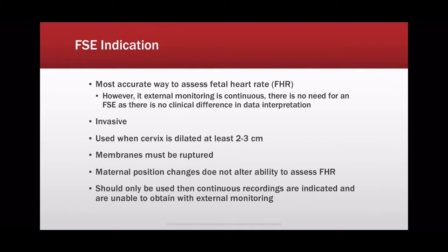Placing a FSE is actually the most accurate way to assess a fetal heart rate when you can't obtain a continuous fetal monitoring tracing. If you have an external monitor in place and it's recording continuously, there's really no need for an FSE because there's no clinical difference in data interpretation.